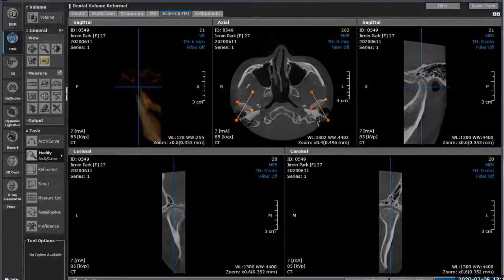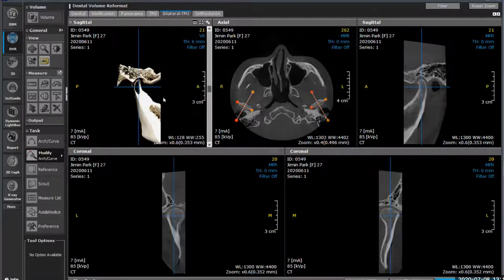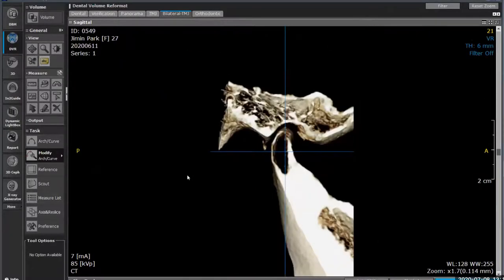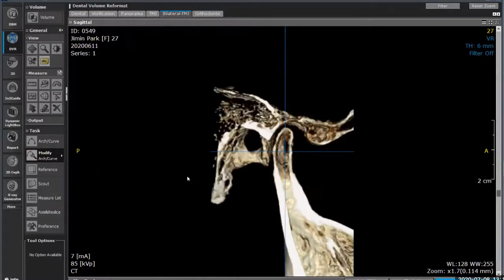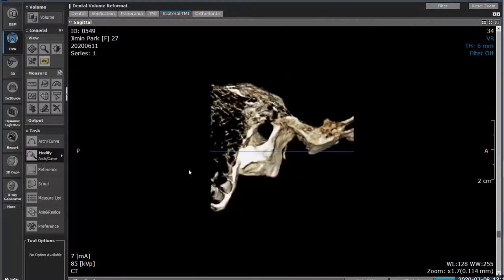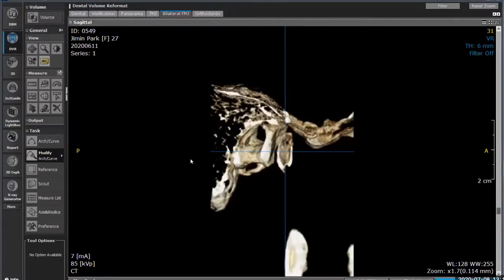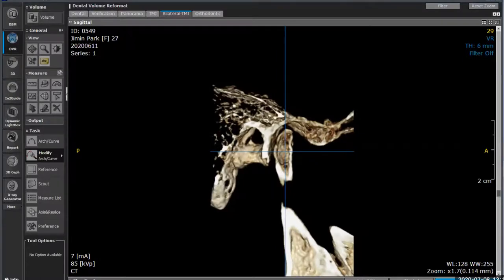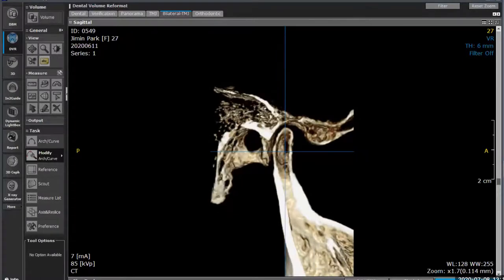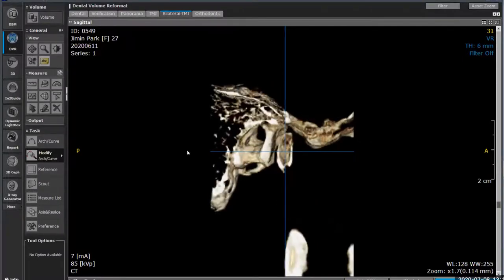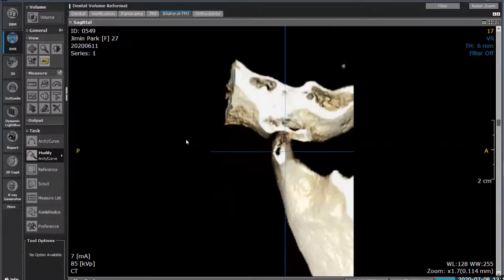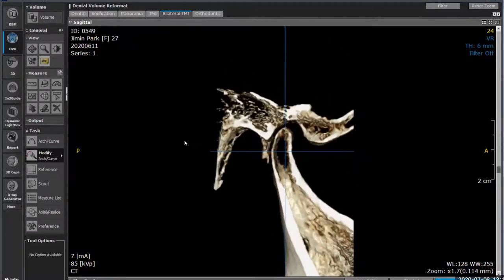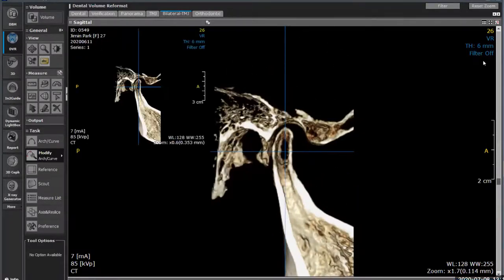We're going to change the bone window in virtual reality to 'bone.' Now we can actually see as we move through how it slices each little bit, and we can see the joint space and the condyle coming in. Moving through, we can see that inequality where there's a lot more space on one side than the other, giving you an idea of the pathology associated with what you're looking at.